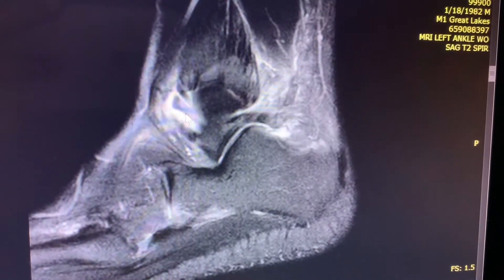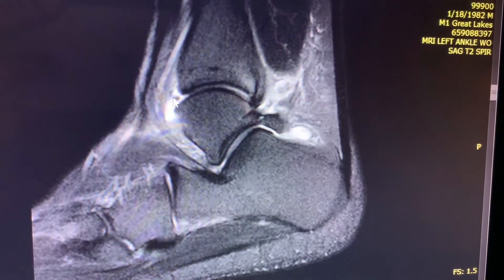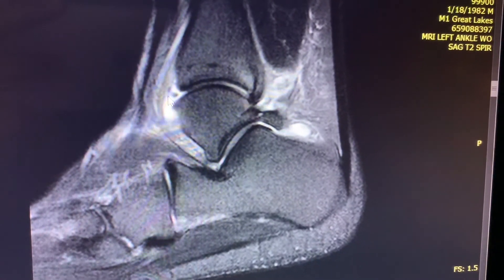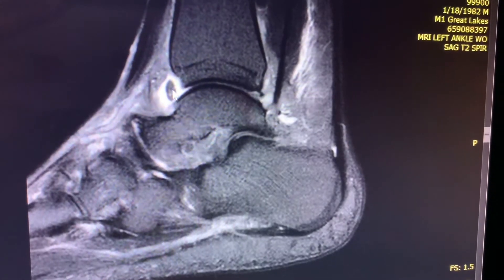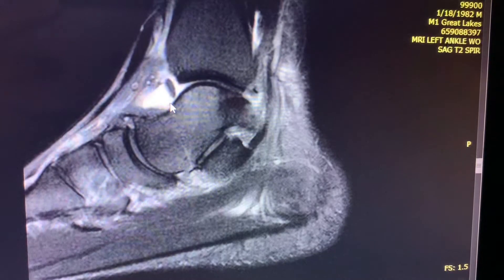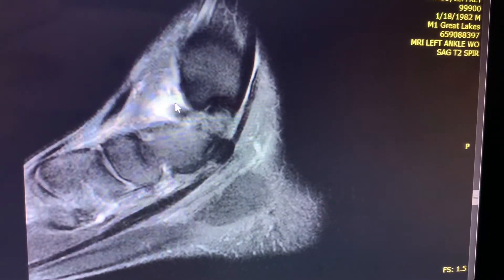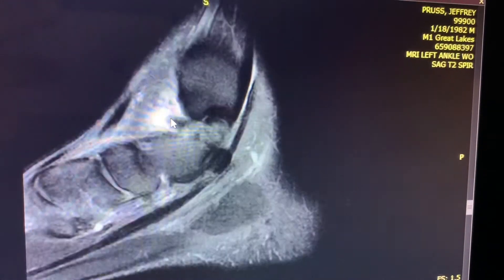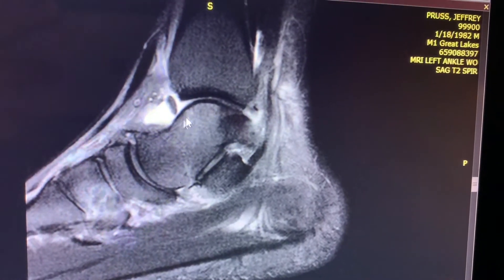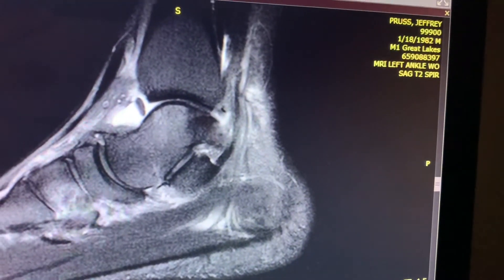This band-like structure arises from the lateral malleolus and goes all the way across the ankle joint, seen within the ankle joint, inserting onto the medial malleolus. Let's also note there is some amount of marked edema in the talus dome. Let's look at the coronal images.